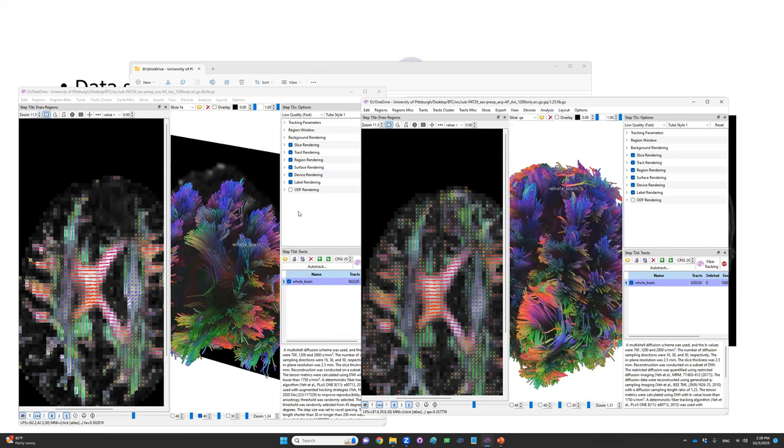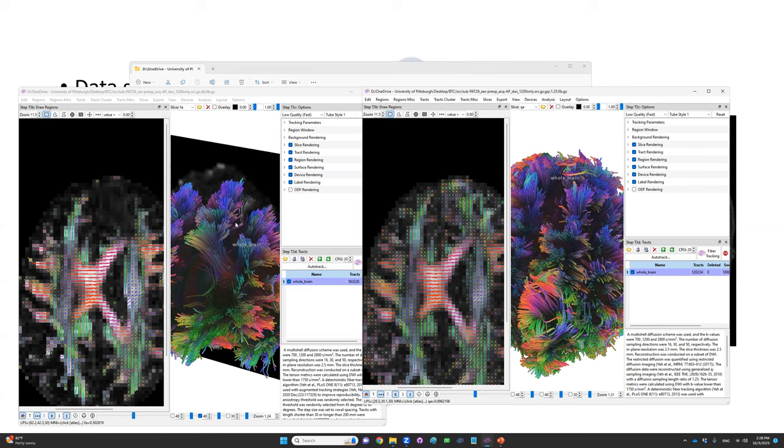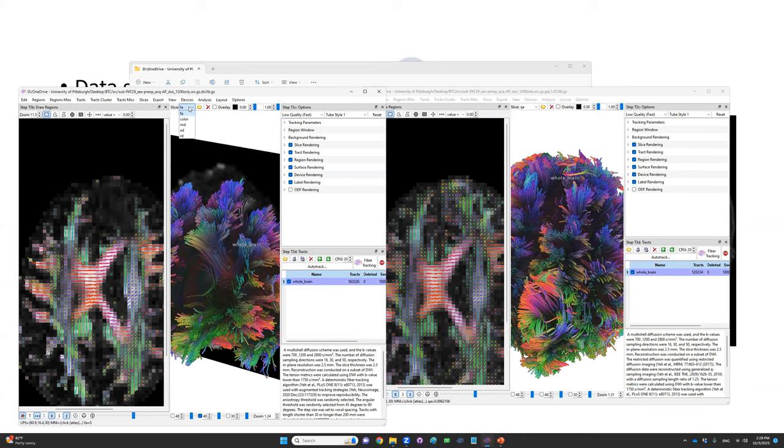This is what I would suggest. Even if you're acquiring DTI data, you should reconstruct it using GQI methods instead of DTI method. You may wonder why DTI method shows empty regions in the FA map. The reason is that FA calculation is based on the ratio between axial-diffusivity and radial-diffusivity.